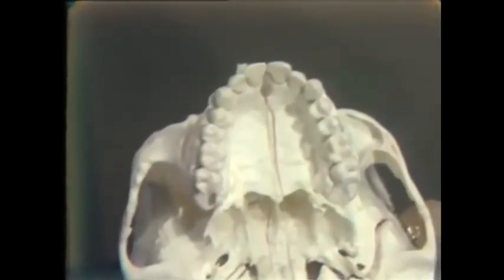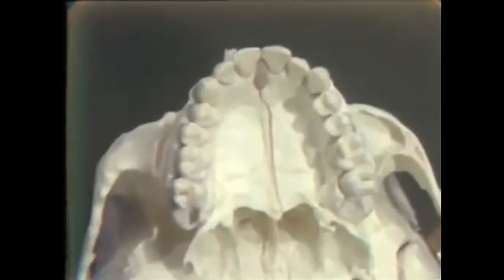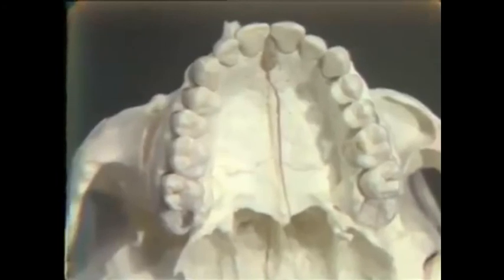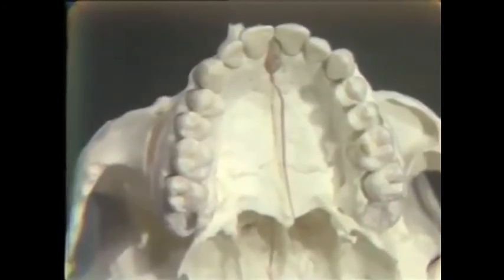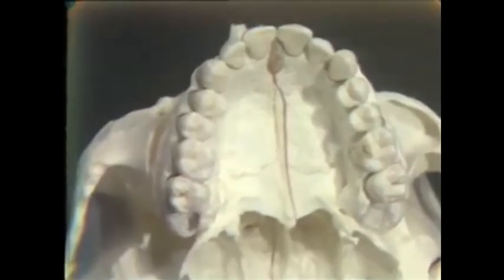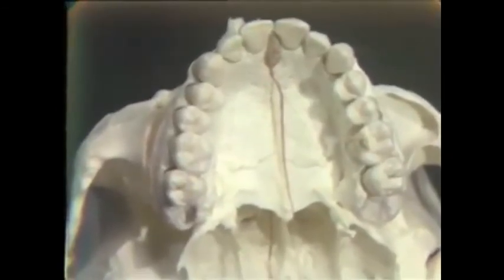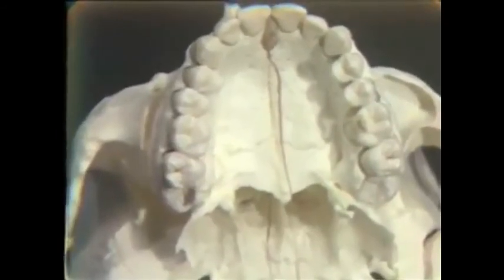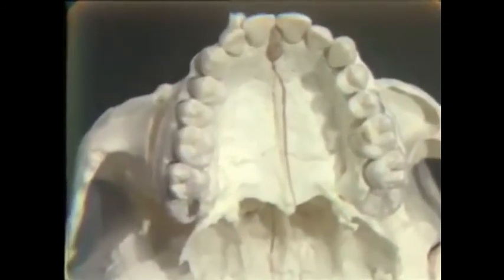One last injection, and again we return to the palate, the so-called nasopalatine injection. The terminal branches of the nasopalatine nerve, as it's coming down from above through the nasal cavity and terminating from the nasopalatine canal at the nasopalatine foramen, or sometimes called incisive foramen, directly behind the two central incisor teeth.